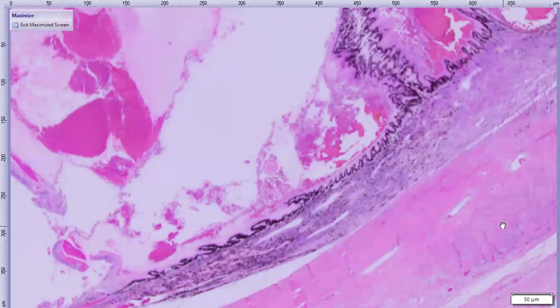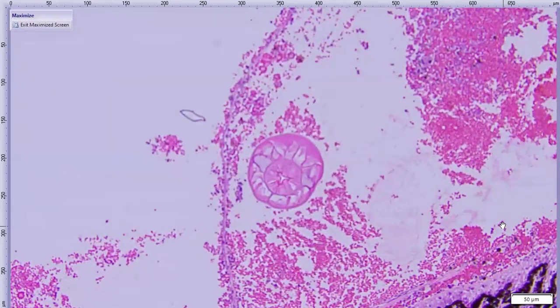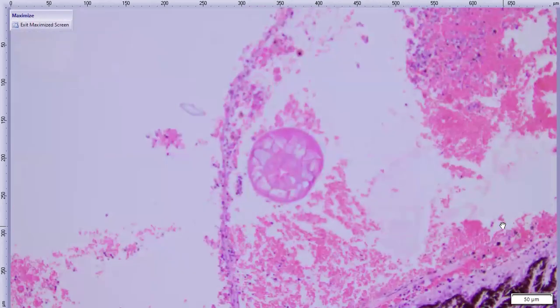I'm not quite sure who this is, unfortunately. I'll go closer while I talk. Oh, just need a good explanation how you got there. Yeah, and how he got here even too. There's a lot of questions for this guy that he's not answering. Unfortunately, yeah, we're pretty rostral in the section, so there's a lot of identifying features that we don't have here.